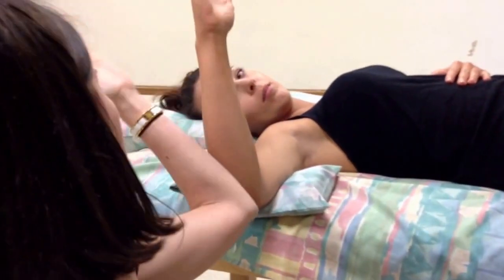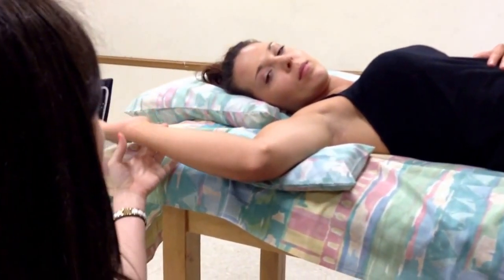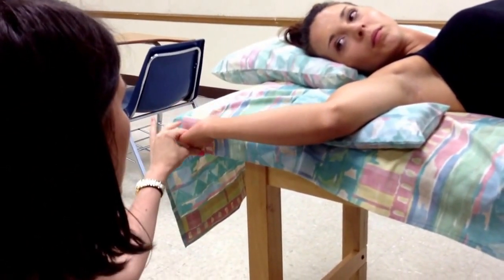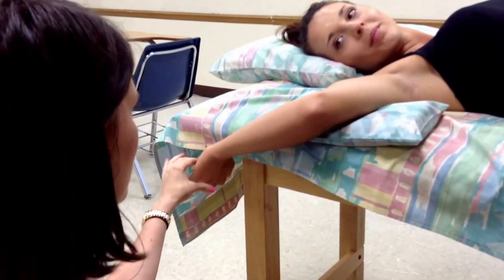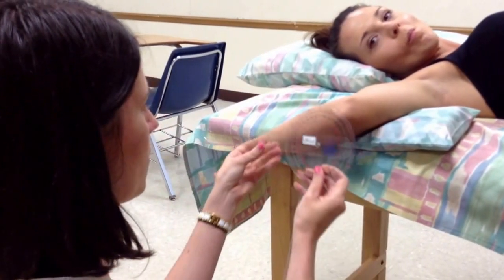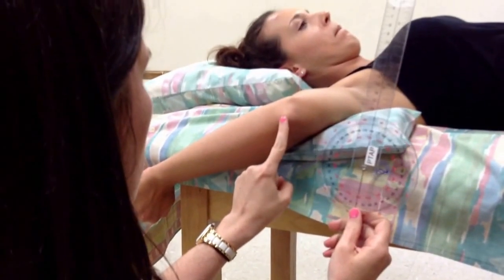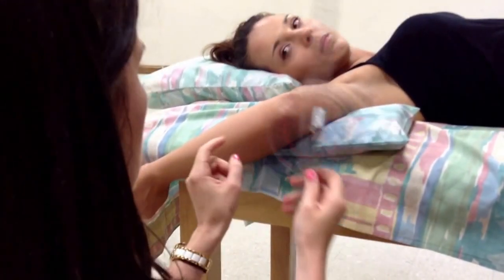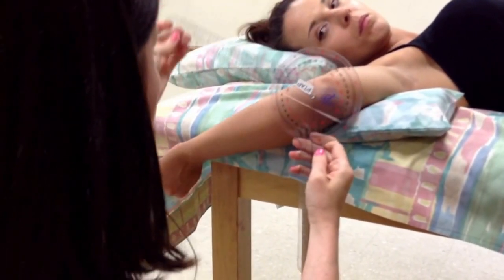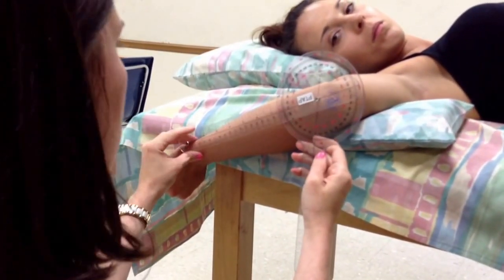I need to be right here on the side of my patient so that I can line everything up. For external rotation, I want you to bring your hand back toward the floor this way. I just need to make sure she maintains 90 degrees of elbow flexion and that the bed isn't in her way. The bed was limiting her a little bit. The fulcrum goes over the olecranon process of the ulna. The stationary arm is perpendicular to the floor, and the moving arm lines up with the ulnar styloid process.